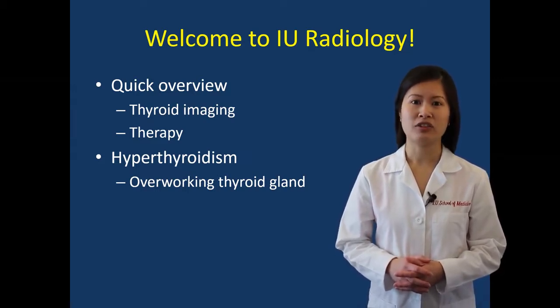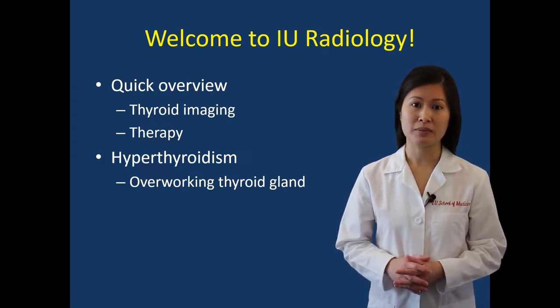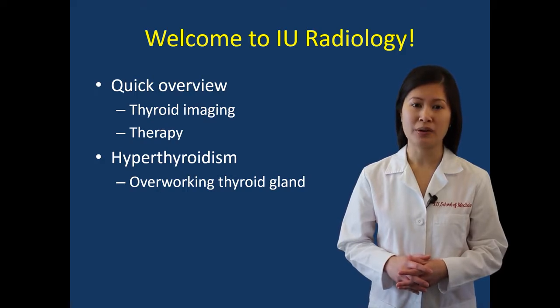Based on a combination of your lab tests and symptoms, your physician has diagnosed you with hyperthyroidism, which means your thyroid overworks and puts out too much thyroid hormone. The imaging test we will start today will help confirm the cause of your hyperthyroidism.